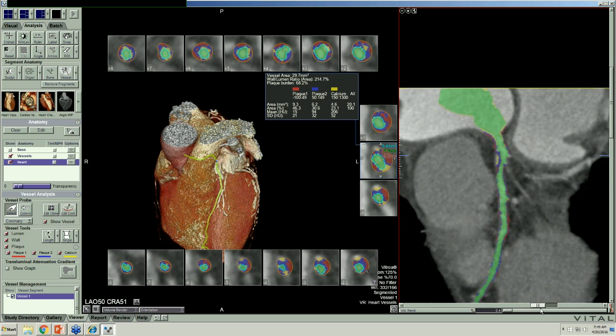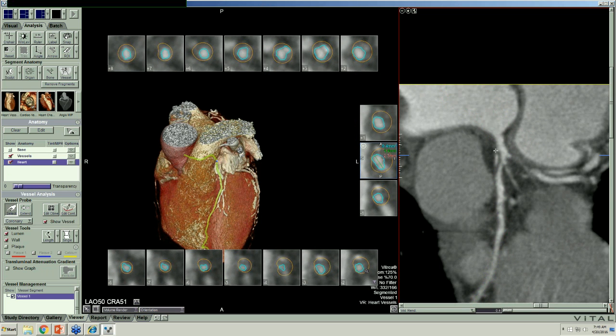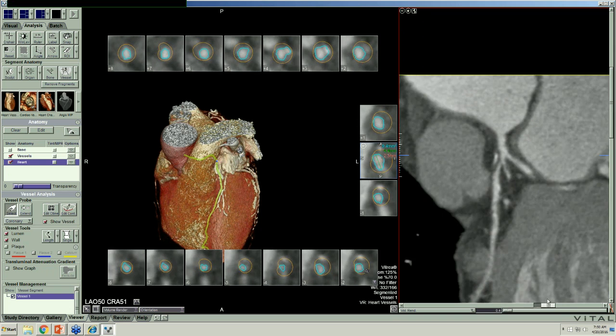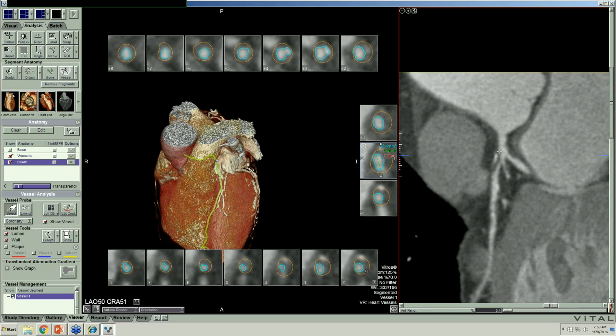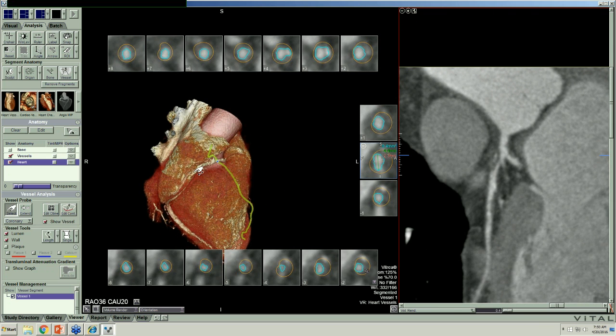And this plaque extends into the main left. I can take this off and show you. It's extending into the main, this is the main left artery here. So it's ulcerated, it's ugly, it's narrowed, it's extending in the main left. And then this is a ramus with a significant narrowing, and this is the circumflex with the significant narrowing. So that looks very bad. It's in this trifurcation that everything looks terrible. Let's go to the right and see what the right looked like.